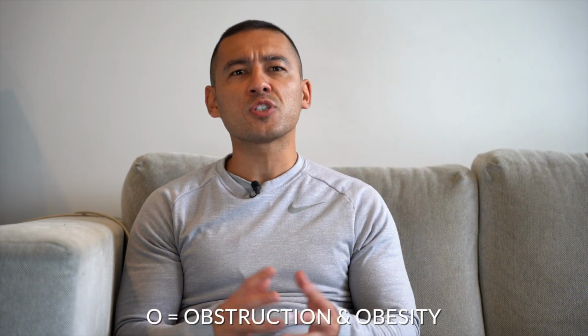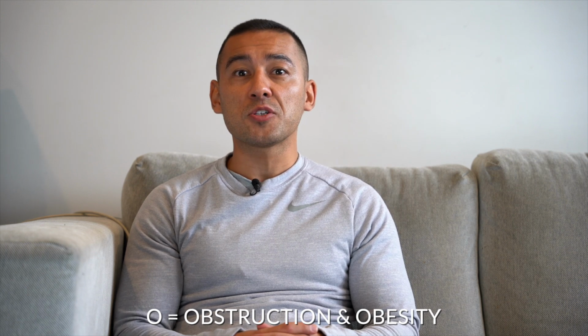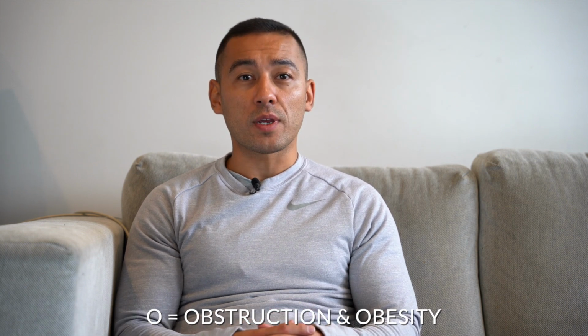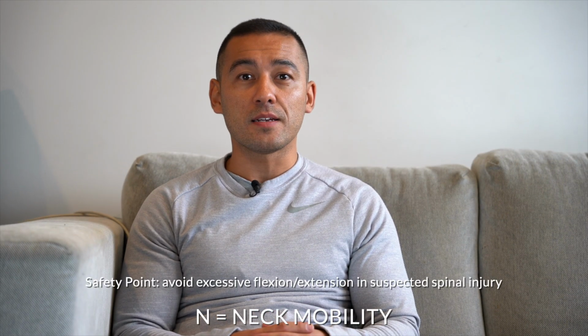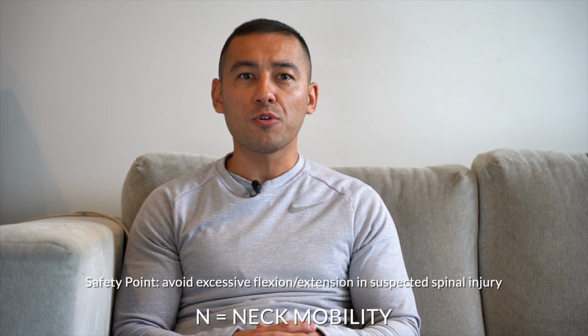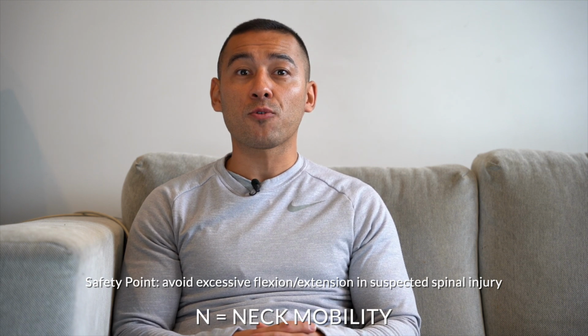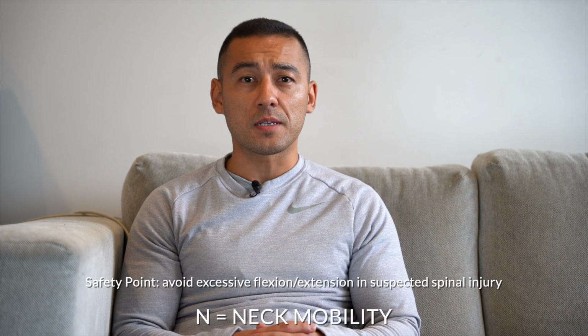O stands for obstruction and obesity. Apart from visualizing an obstruction, it is important to take note of changes in voice, difficulty swallowing, dyspnea, and stridor. N stands for neck mobility. Check that the patient can flex their neck and extend their head. Inability to perform this due to a diseased vertebral column or spinal precautions can make viewing the glottis by direct laryngoscopy very difficult, and therefore video laryngoscopy should be considered.